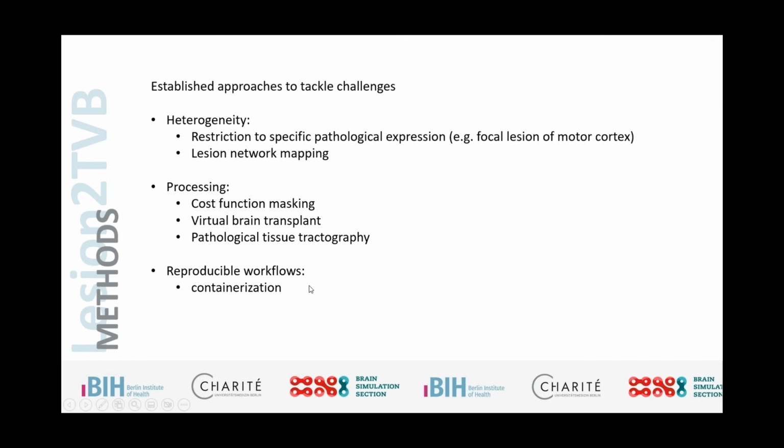And the other one is, even though we have a lot of different stroke data available across different centers, people do a lot of manual adjustments, etc. This really impacts reproducibility and comparability between the different studies and the results. And containerization is one of the main aspects to tackle this challenge, by making a container available to everybody so they can apply the exact same processing procedure to their data and make the results comparable. So those are pretty much the four aspects that we looked at.